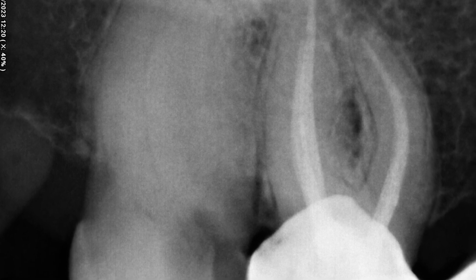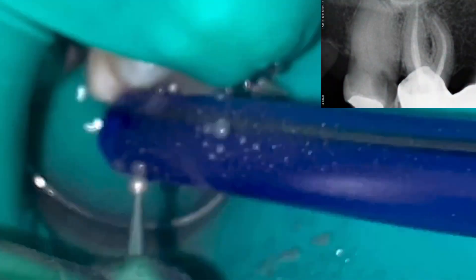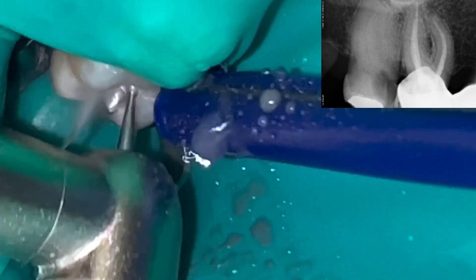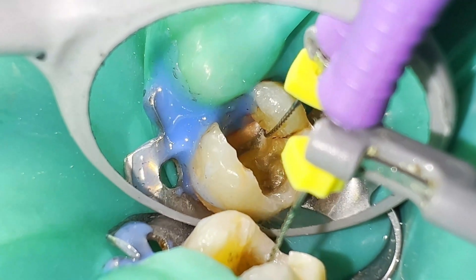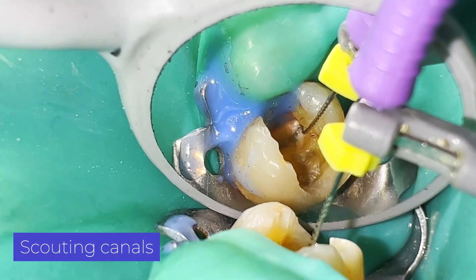We perform the access cavity and remove all the amalgam to inspect the chamber floor in search of fissures and cracks. We locate the root canals and managed to reach working length with some difficulty.